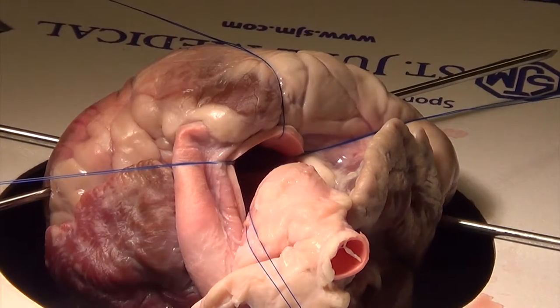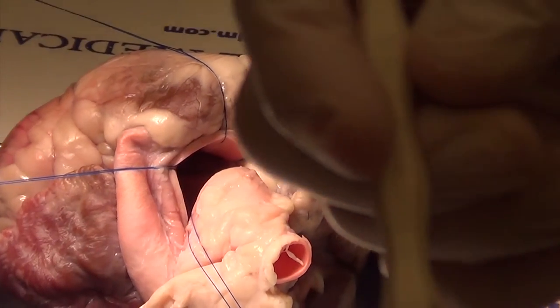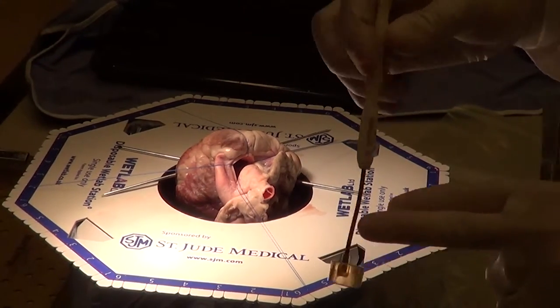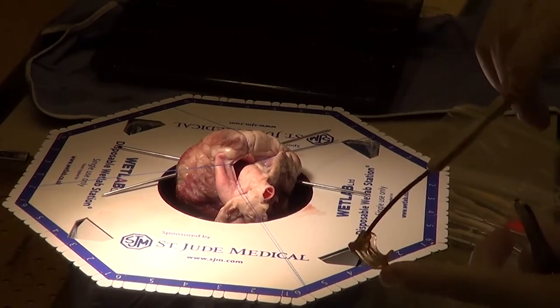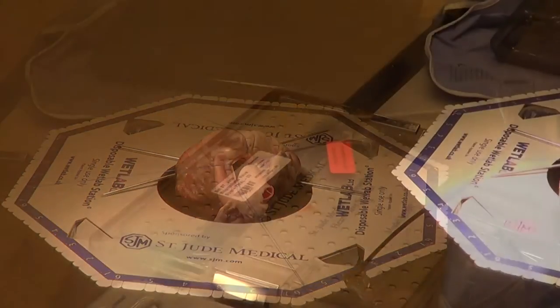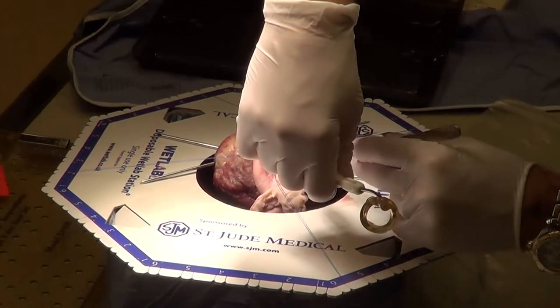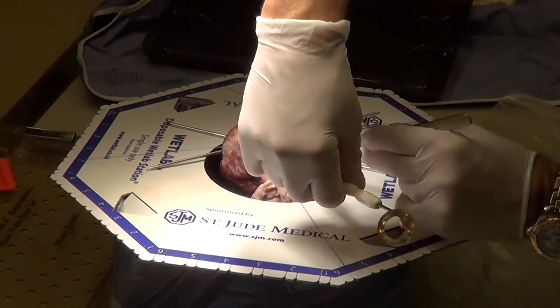This is probably the size of the valve that we're going to end up putting in. This is a 19mm valve, a 19mm sizer. This is the sizer component and this is what the valve will look like once I put it in. I've got the sizer and I'm going to try and fit it in, and it goes in there.